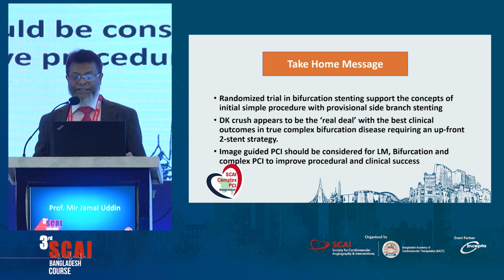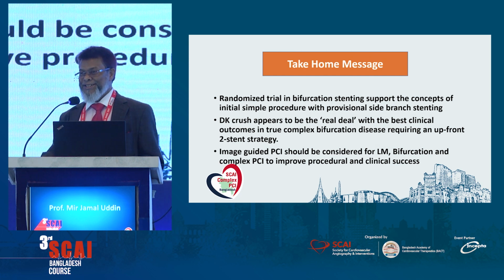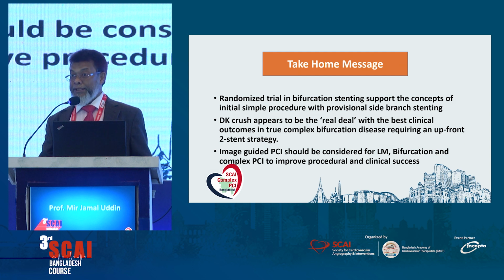Randomized trials in bifurcation stenting support the concept of an initial simple procedure with provisional stenting, as Dr. Imad told, that was an old concept. But I, with humble submission, differ a bit, because we have seen the 3-year results of EBC MAIN. Even then, we do not rely only on the philosophy of provisional stenting, because they have not taken all types of complex lesions, and that is why they remain within that philosophy. Beyond the philosophy, there is something we shall have to think about.